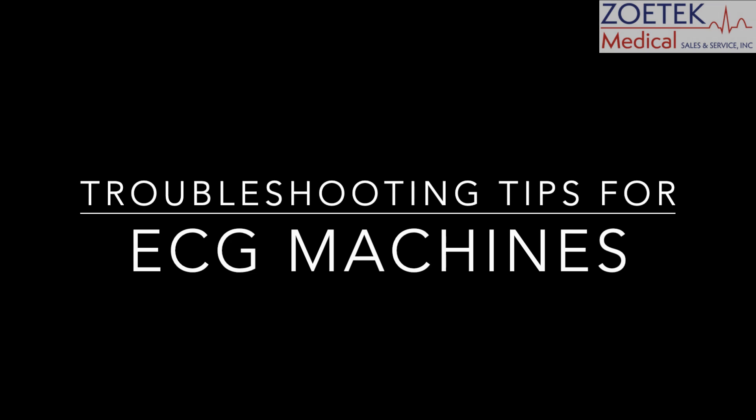Today we will be diagnosing several common EKG failures and implementing effective troubleshooting methods.